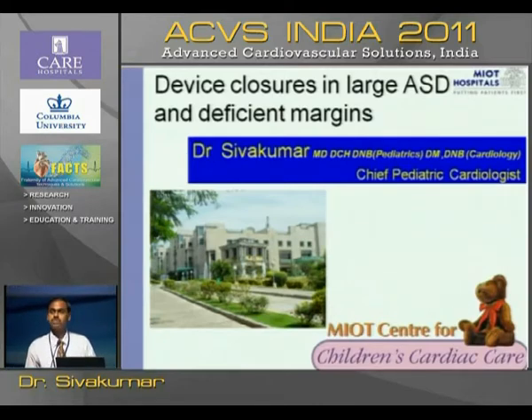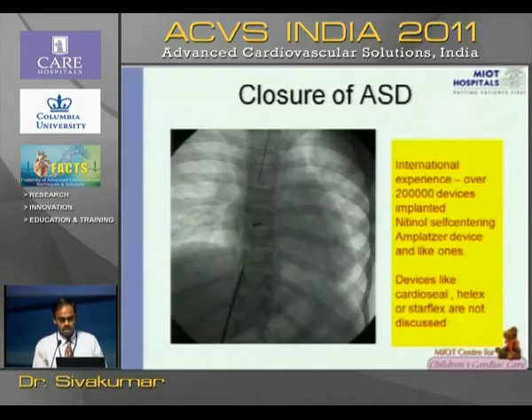We are going to discuss for the next around 15 minutes or so about device closures and large ASDs with deficient margins. Primarily this talk will be all about utilization of the Amplatzer or Amplatzer-like nitinol-based self-centering devices.